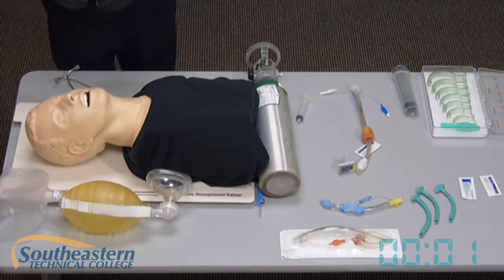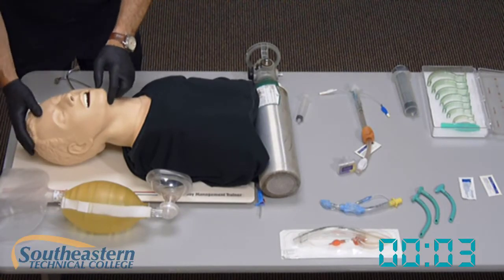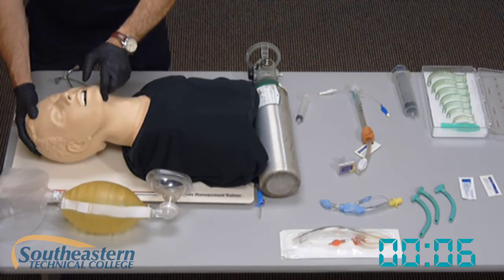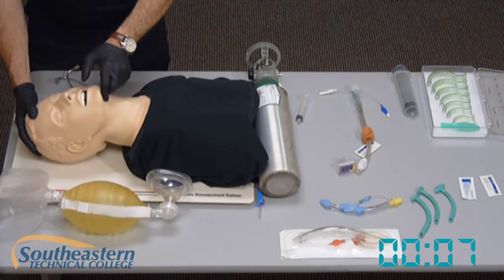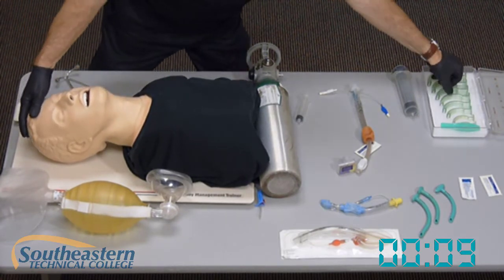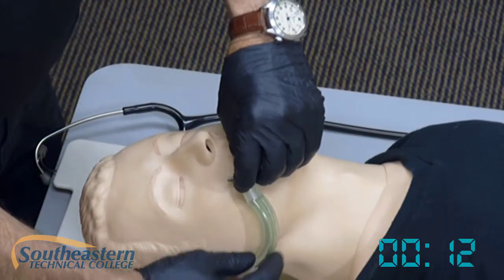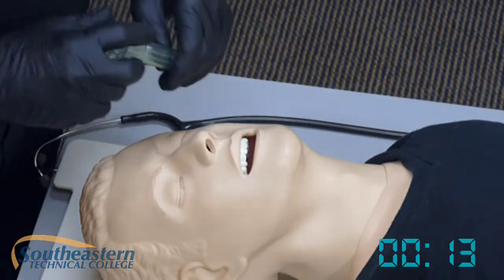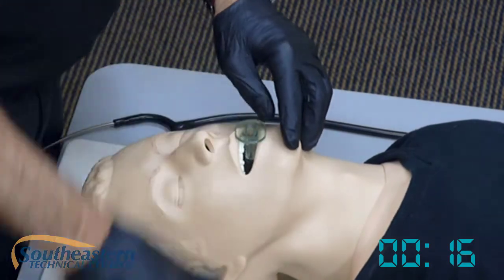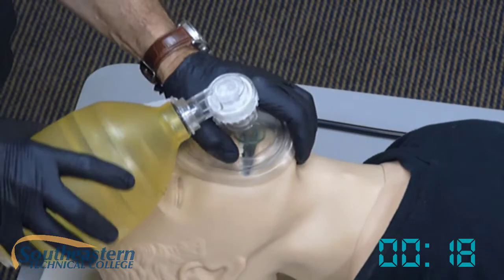We're on scene with our gloves on, making sure that our scene is safe. We want to open the airway with a head tilt-chin lift to verify that the patient is not breathing. The patient is not breathing. We're going to choose the appropriate sized oropharyngeal airway, insert it, and begin ventilation of our patient.